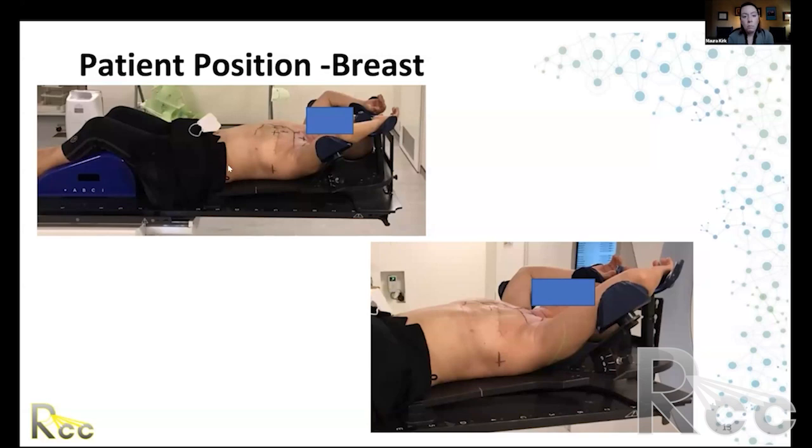So in my experience, sometimes we will mark the patient on both sides, in an area lower down and off of the breast, so that we have somewhere where we can make sure the patient isn't rolled, and that we have them laying with the same roll flat on the table as we did at simulation.